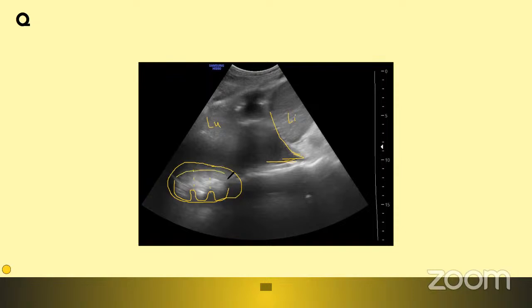So what structure really passes deep to the thorax, which you can appreciate in this shape classically? Any ideas? Just make your guess. Be intuitive. We are getting some hyperechoic structure in the shape of these serrated, not serrated, corrugated ends.